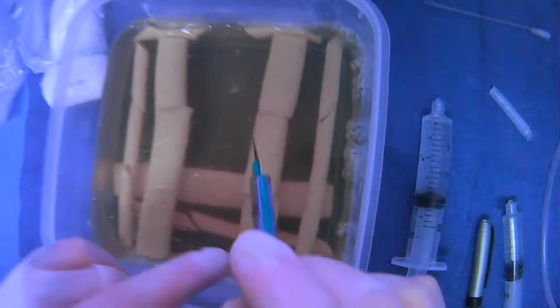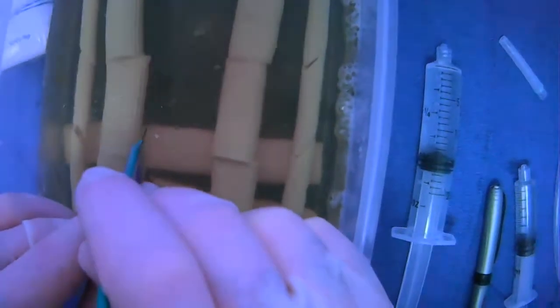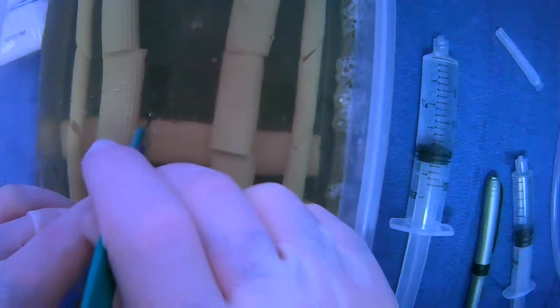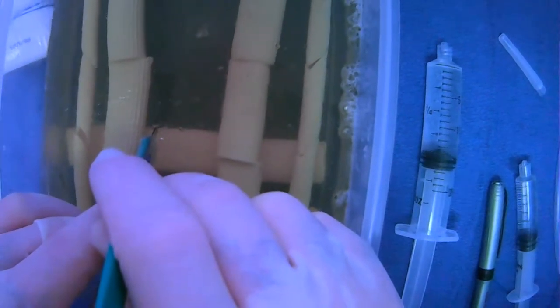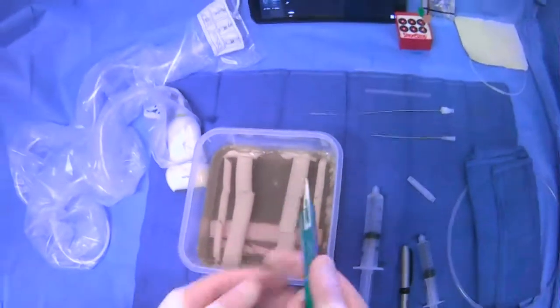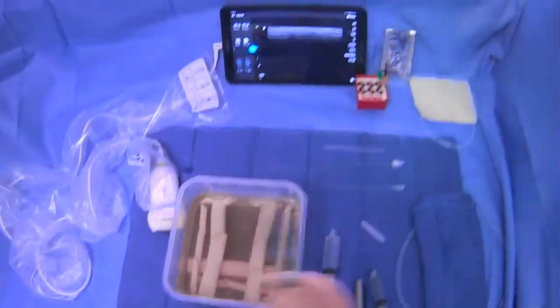We just go back now to where our marking was and where we made the wheel, make a little dermatotomy, not very deep. We just go in a little bit, puncture the skin, and on the way out we make a little nick. A little dermatotomy in the skin, which is going to mark where we're going to go.